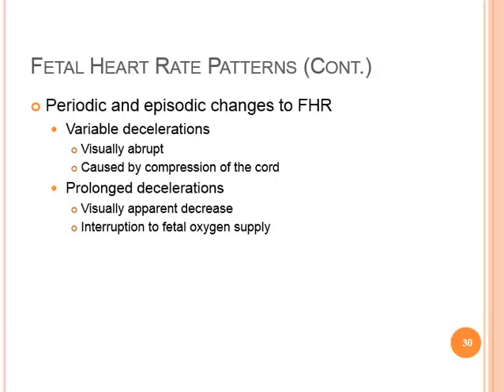The appearance of variable deceleration differs from those of early and late decels, which closely approximate the shape of the corresponding contraction. Instead, your variable decelerations have a U, V, or W shape characterized by a rapid descent and ascent to and from the nadir of the deceleration.